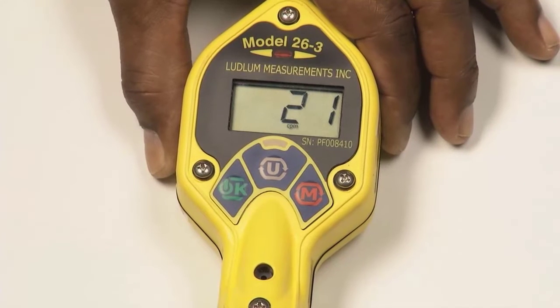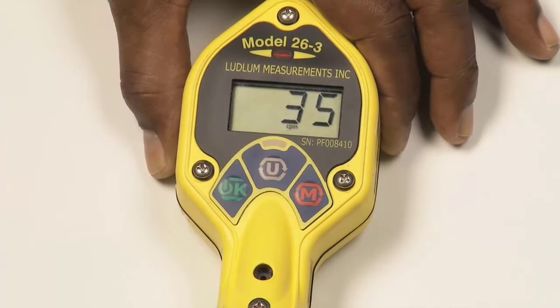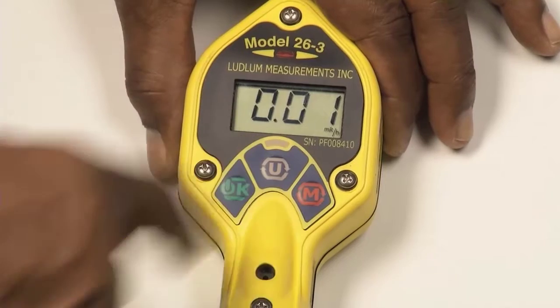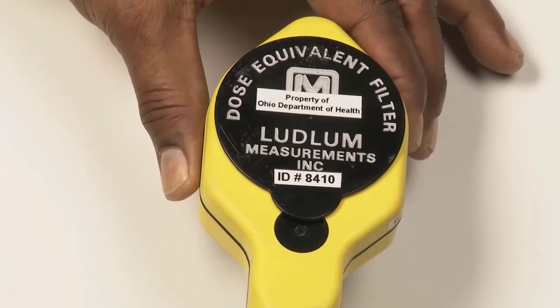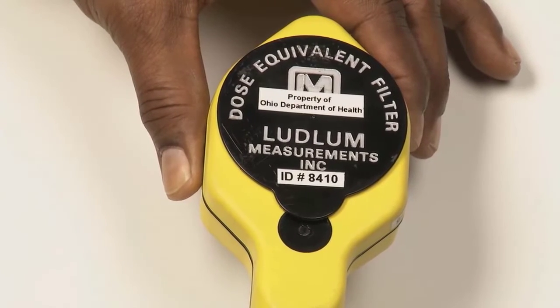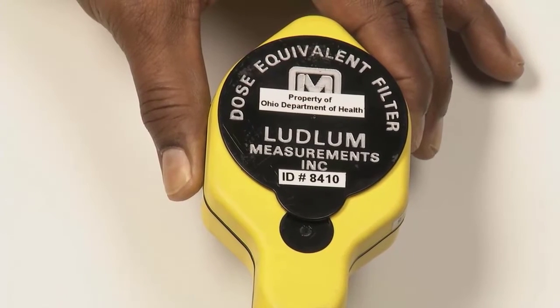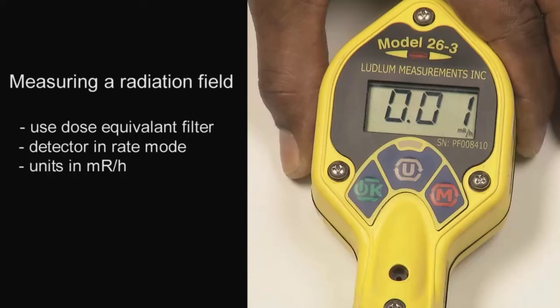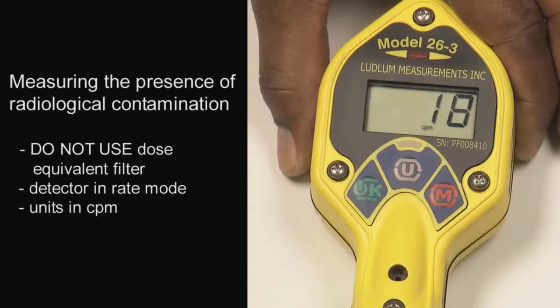The 26-3 defaults to CPM when it is turned on and is used to measure radiological contamination. If the operator wishes to measure exposure or dose rate, press the Unit button to change the units to mR per hour. If the operator is measuring dose rate, the snap-on dose equivalent filter should be used. If the dose filter is not used, the detector will over-respond to low-energy gamma radiation in the 20 to 150 kiloelectrovolt range. If the operator is measuring a radiation field, the dose equivalent filter should be used and the detector should be in rate mode with units in mR per hour. If the operator is measuring for the presence of radiological contamination, do not use the dose equivalent filter — the detector should be in rate mode with units in CPM.